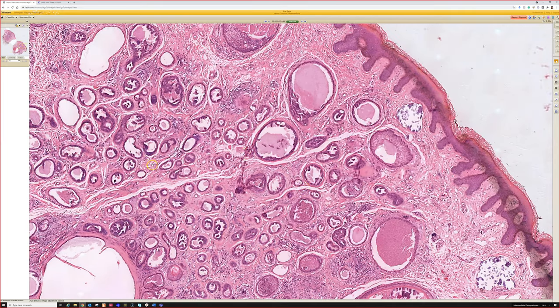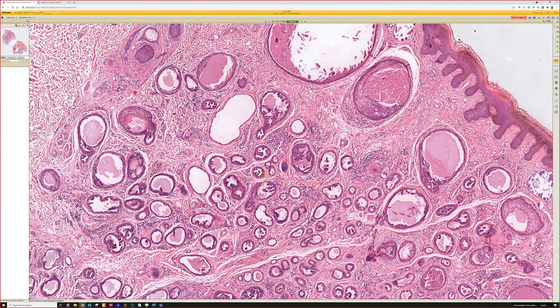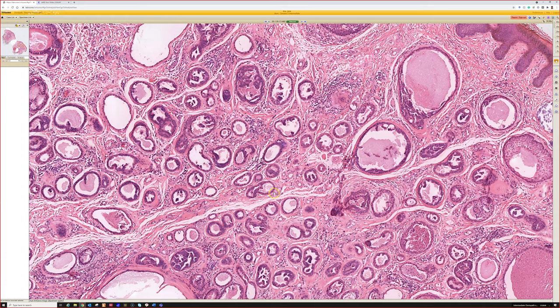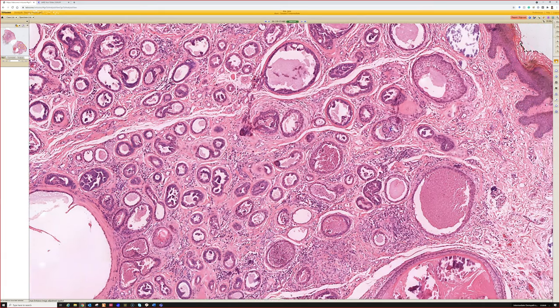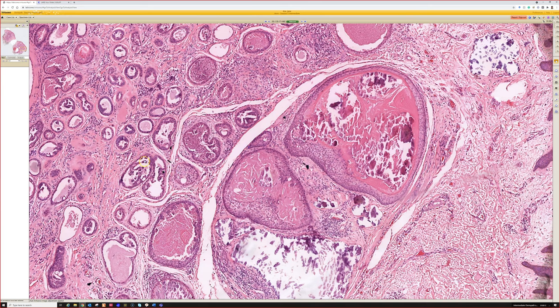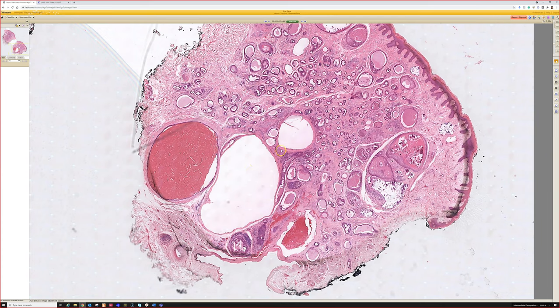And do use caution if you see something like this on an acral surface because with the papillary structures, I have occasionally seen cases of digital papillary adenocarcinoma that had some overlapping features with this. So I would use caution when you see something like this in an acral location. And I would ideally want to see the whole lesion in that case. All right, so that's a pretty good example of a rare entity.